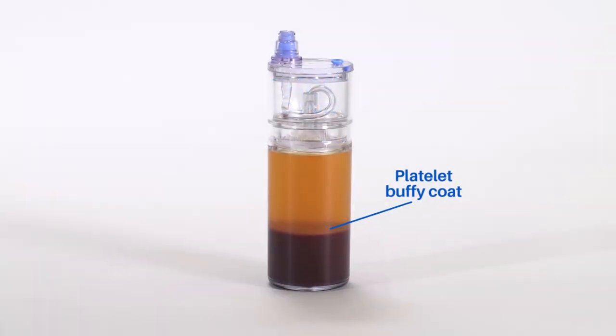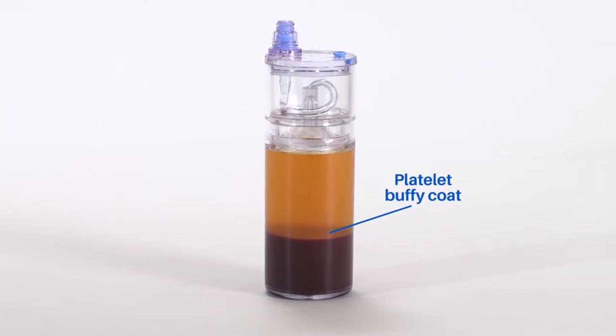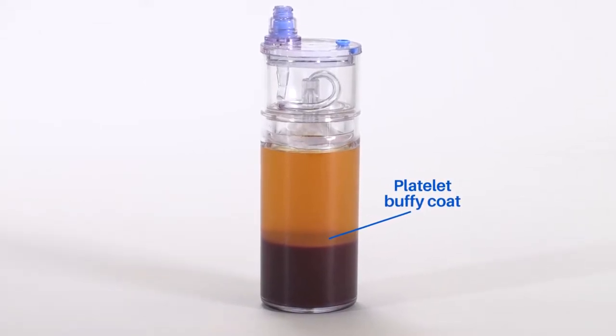After centrifugation, the platelet buffy coat layer will be clearly visible between the plasma and red blood cell layer.